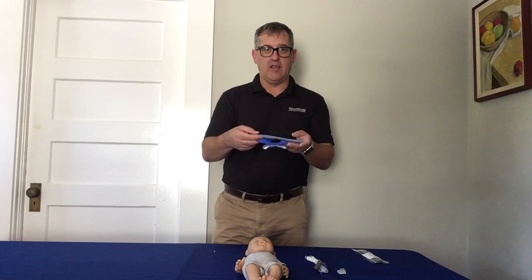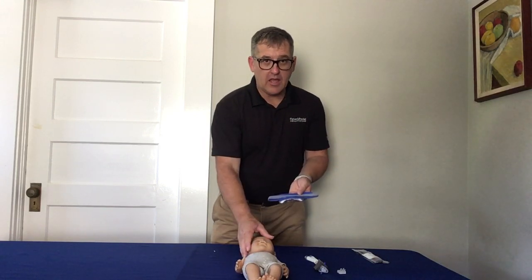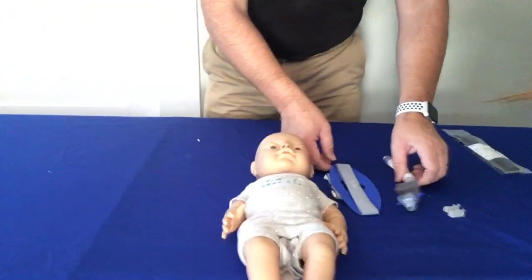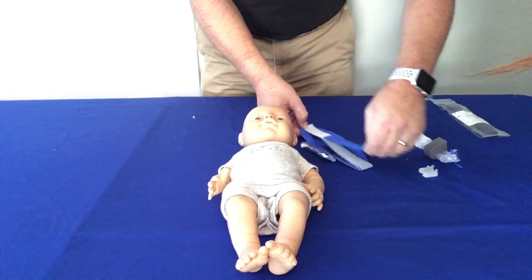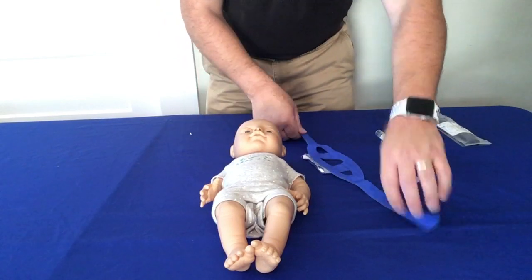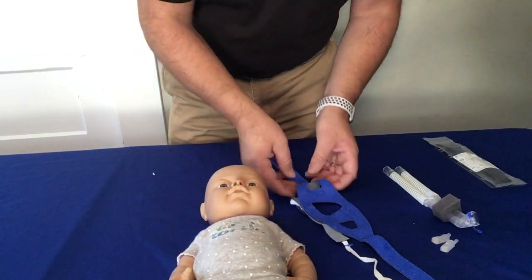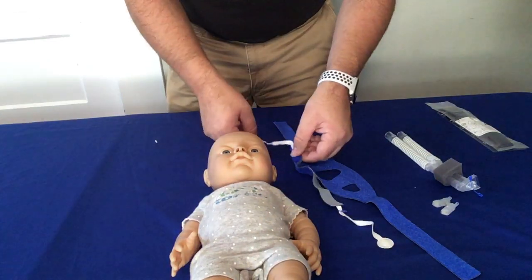When you have the headgear like this, what you first want to do is open it all the way up like the bonnet. So we're going to go ahead and put this onto the baby. I'm going to show you how to open this up. Okay, so first things first, open up the headgear all the way, and it does have this very aggressive Velcro located like so. So open it all. It's going to stick to everything within your incubator or your infant warmer, whichever one that you're using. And then do yourself a favor and open up these back straps as well, making sure that the blue part of the headgear is facing up towards the ceiling.